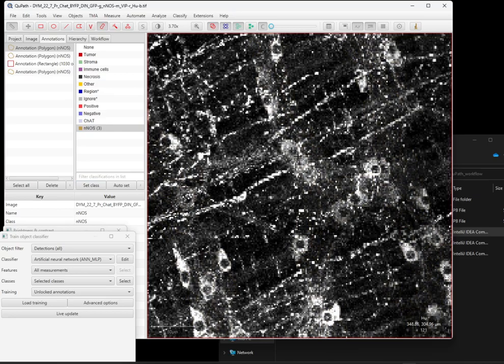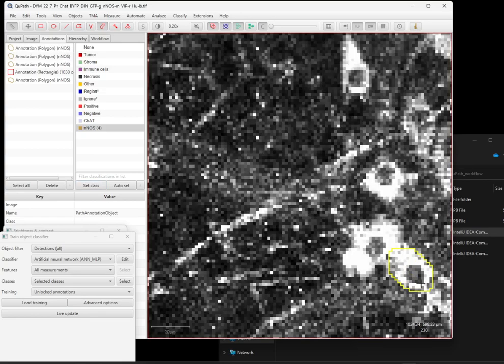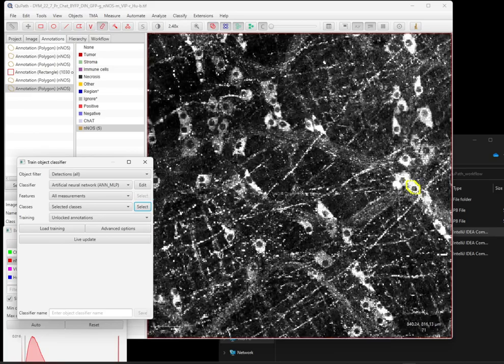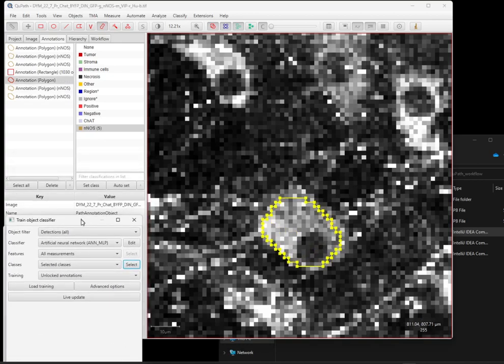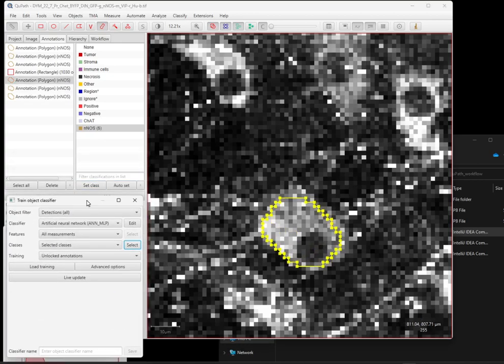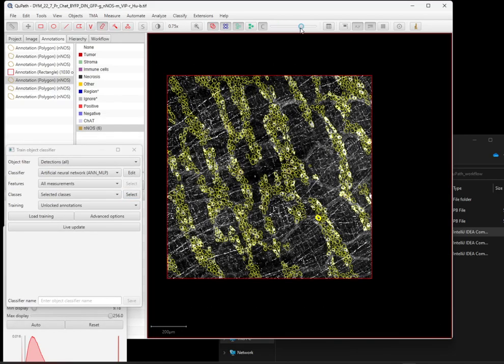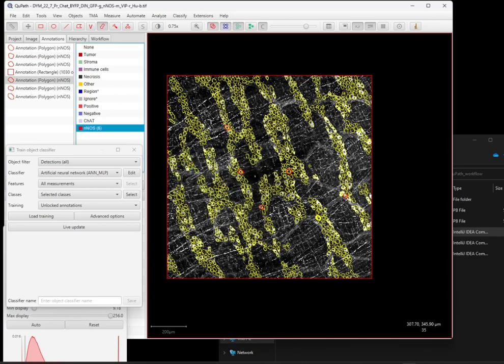Cells, yeah, cells there. So that's NOS too. NOS as well. Alright, so got a few. I'll do this as well. Got a few here. Now let's see how all this works. I will increase the opacity and maybe I'll change the color to something like red. So if it's NOS, it'll become red in color. Alright, so those are the annotations we had.